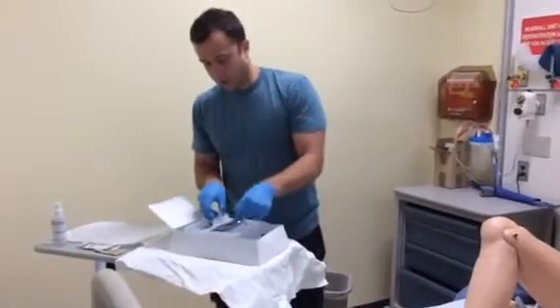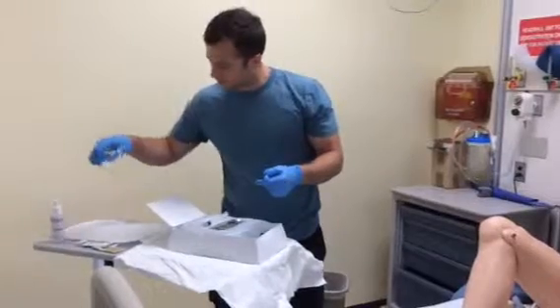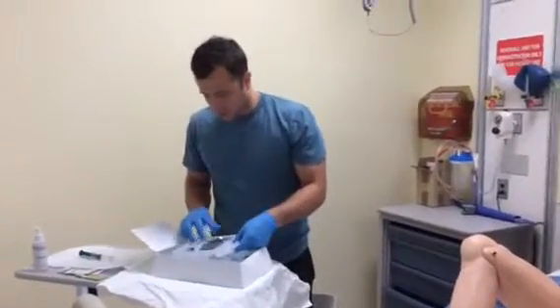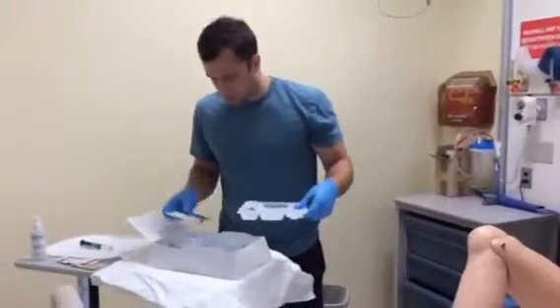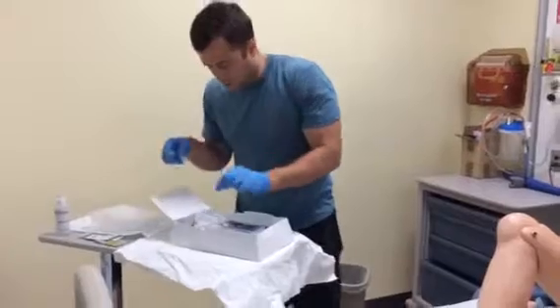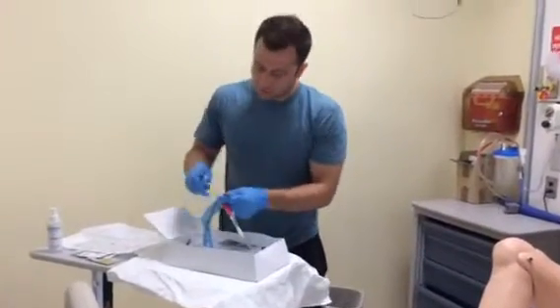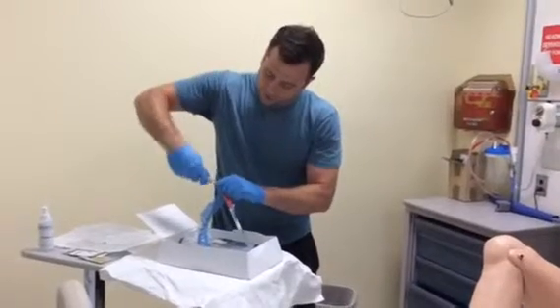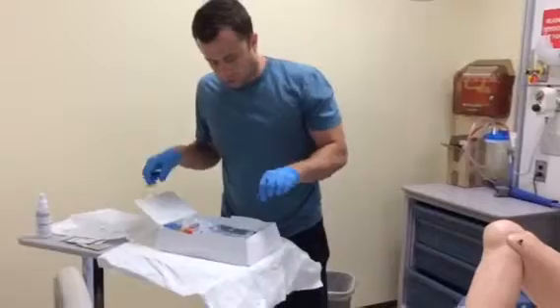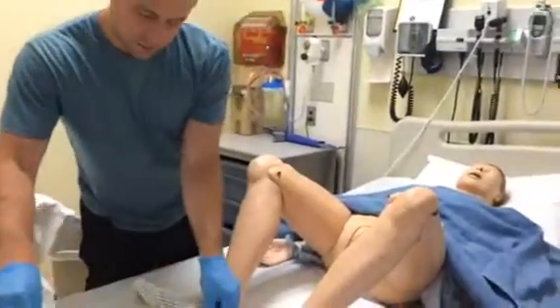And so I would go ahead and shoot this lubrication into this bin here, set that off to the side. And I'm going to go ahead and attach this sterile water to the side of the Foley there, twist to make sure it's tight, and then we're going to be all set to move this over by the patient.